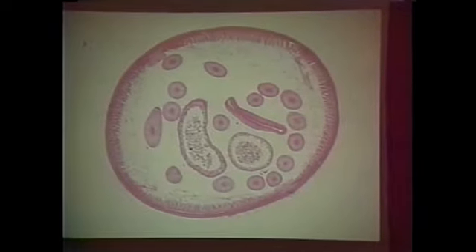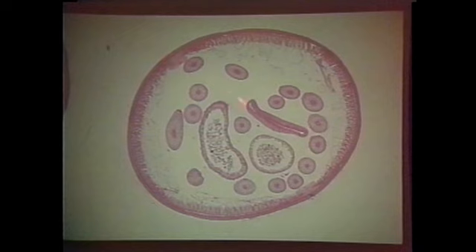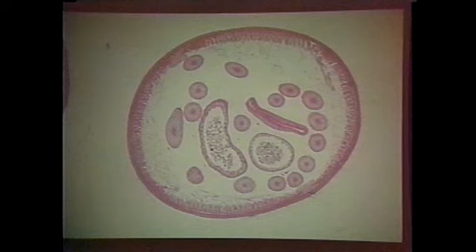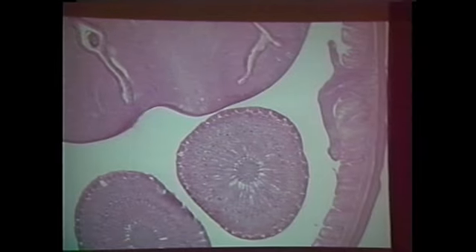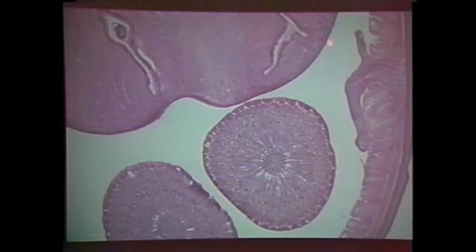This is Ascaridia. Notice it has a very small lateral ala here. It's a female because it has all these tracts. Now, other ascarids, there's many ascarids in animals. This is a type of ascarid, Anisakis, but also Contracaecum and Porrocaecum. They are parasites of marine mammals, and the lateral cords kind of come out, and they can look like a butterfly wing. And you can find that both in the larvae and the adult.